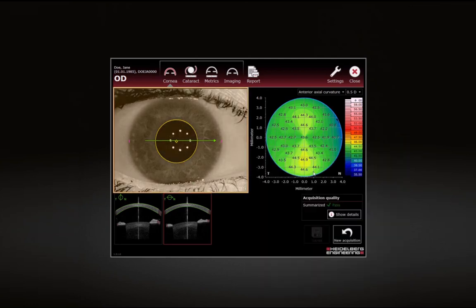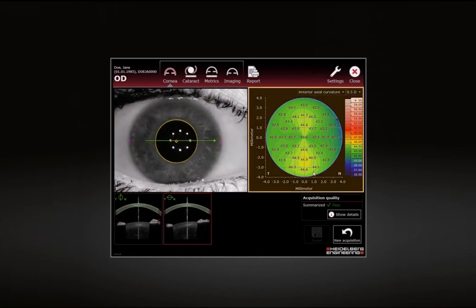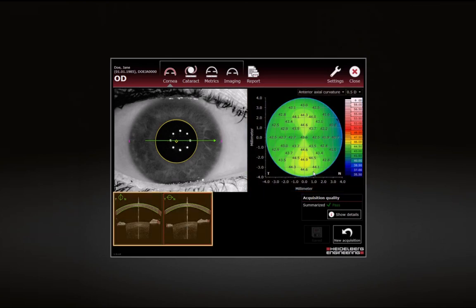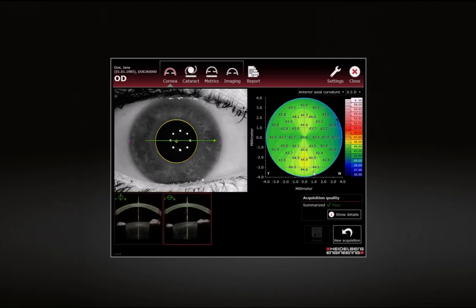Check that the camera image is sharp and the pupil and/or white-to-white boundaries are acceptably segmented on the infrared camera image. Check topographic data for missing information. Review the segmentation of the OCT section image. If the boundary of the anterior corneal surface is not correctly detected, please re-examine the patient. To acquire additional images, tap New Acquisition.